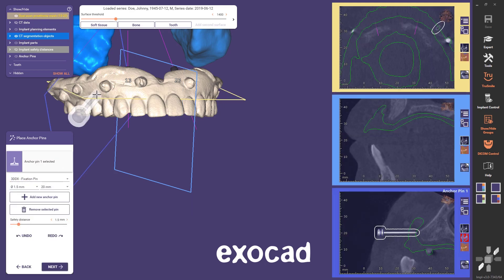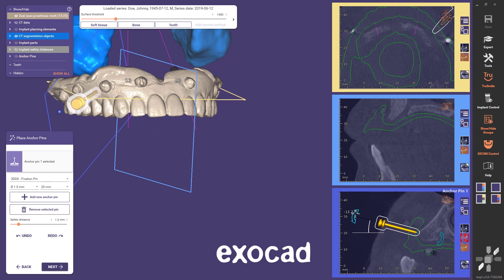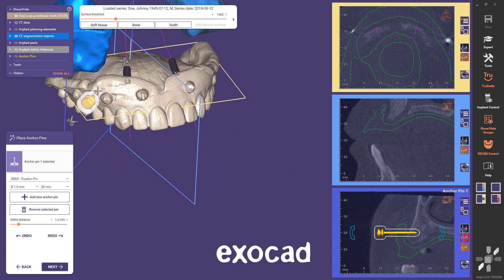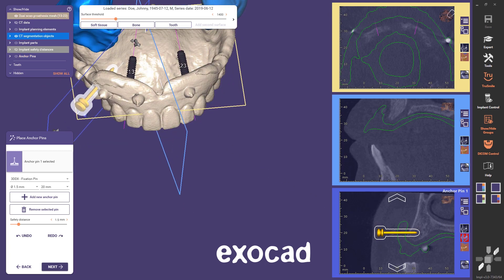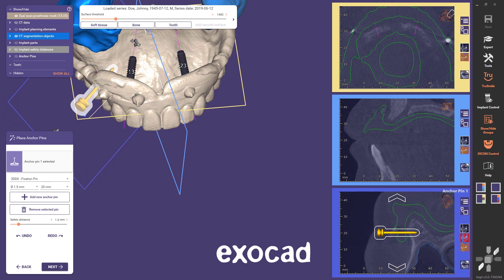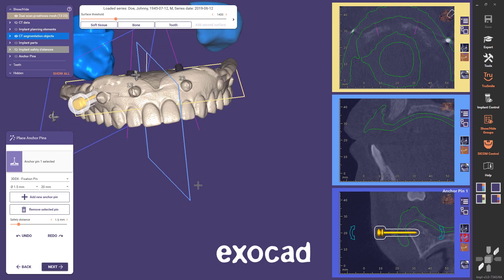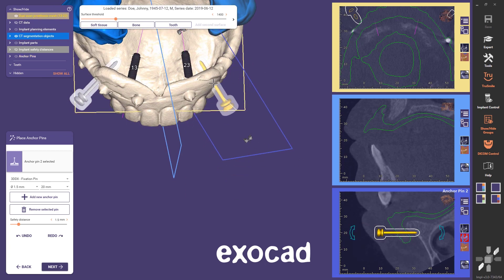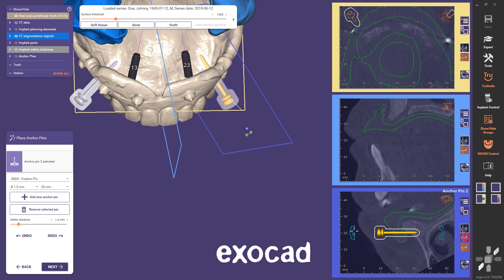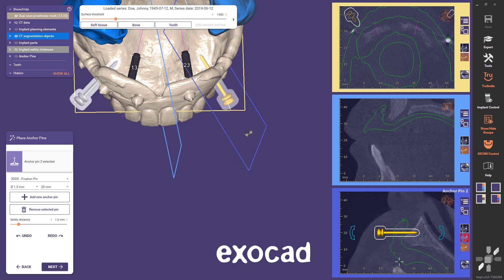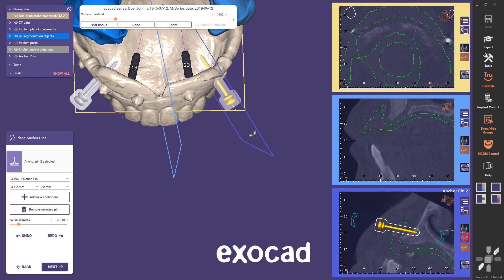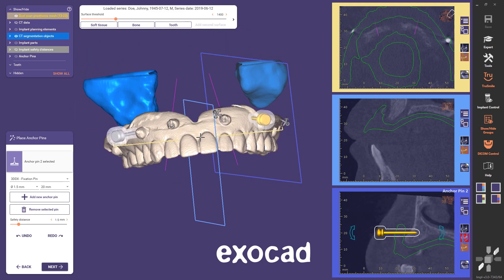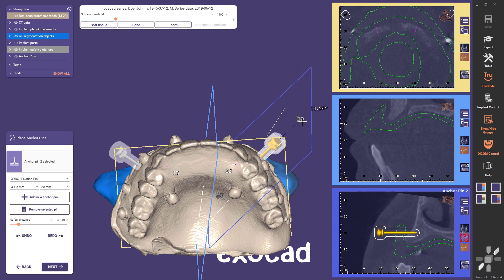I can select an anchor pin from the drop-down menu and place it roughly in the 3D view. Then I have a secondary view in which I can also adjust the placement of the anchor pin using the arrows, both in the secondary view and in the 3D view. I scroll around to check that it's placed correctly. I will place two anchor pins for this case. If I come too close to an implant, I'm alerted. Important to remember is that the patient has cheeks, so you can't place the anchor pins too distally.